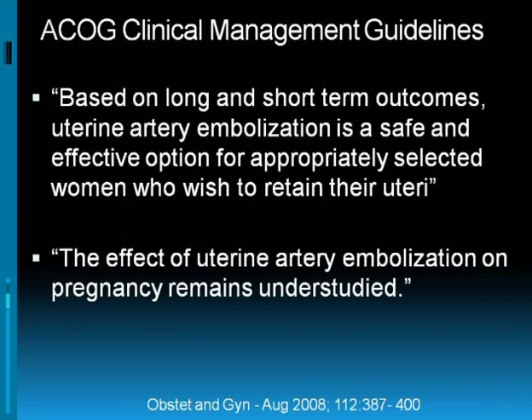And this slide I put up here because this is just a testament to how well accepted UFE has become. These are statements from the American College of Obstetrics and Gynecology's clinical management guidelines.